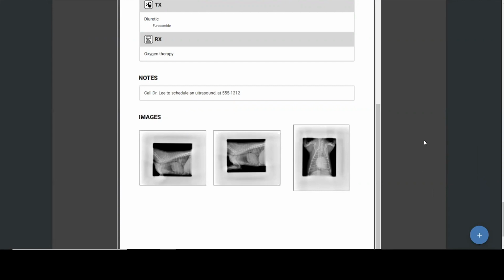So there are many ways that you can get this information into the patient file, and also give it to the owner. And I really like this because it's something tangible that you can hand to the owner and demonstrate the value of radiographs. Because radiographs a lot of times are relatively expensive, maybe one of the most expensive things on their charge sheet. And so here you can demonstrate the value and also show them how the radiographs potentially affected the case as well.